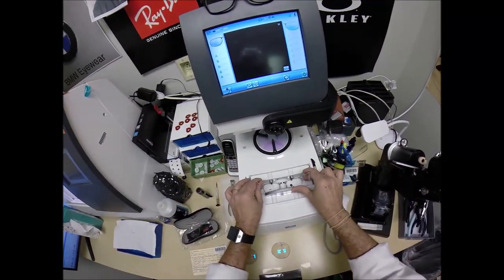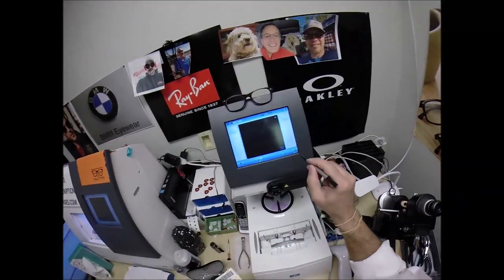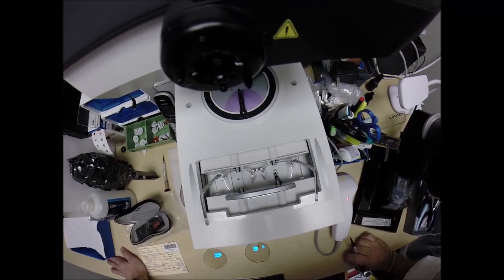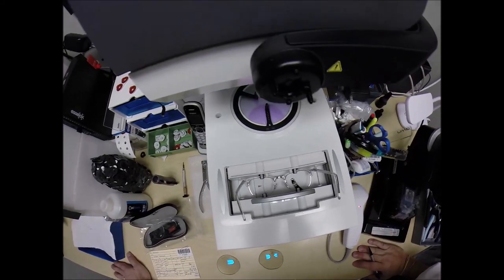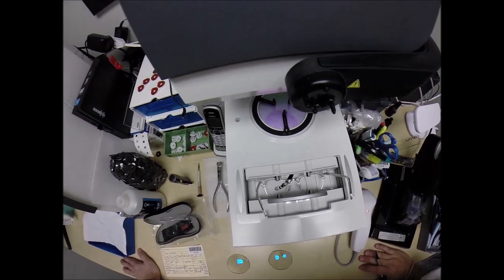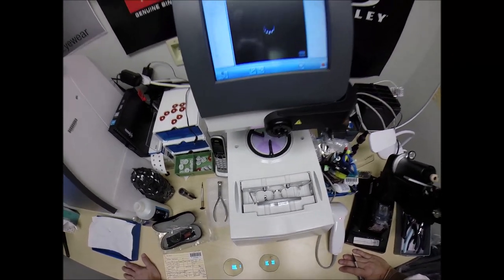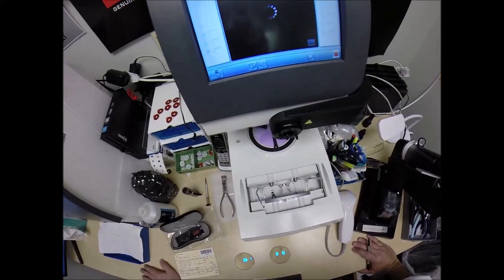I'm going to put the frame into the tracing element of my blocker, but first I want to program the shape into the computer — several computers now, not just this one. It's going to go to the cloud. Hit start, and now the stylus is going to trace the inside of the right side of the frame, then the left, here at freeprescriptionlenses.com, where everyone loves a bargain and no one is disappointed in quality.